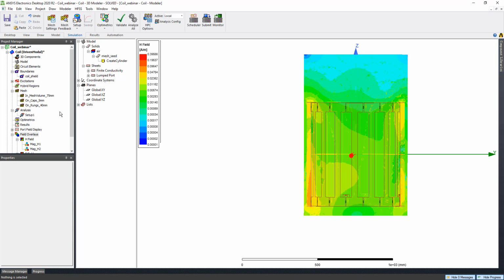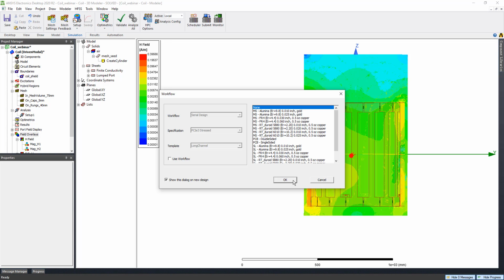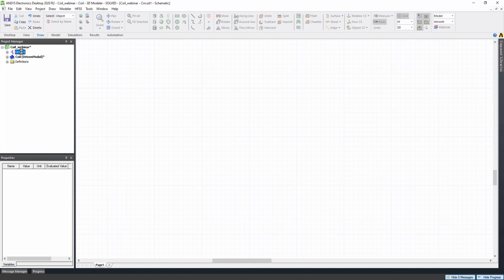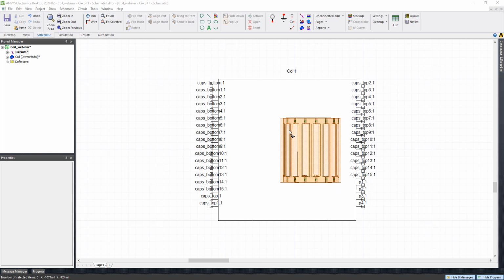We want to link the design to the tuning capacitors. Okay, so I'm going to go into project. I can insert circuit design. I click done. Okay, so now the next thing I want to do is you can either right click copy and paste, or you can just drag and drop. So now we have our design here. I'm going to arrange the pins a little bit, or actually I don't have to.